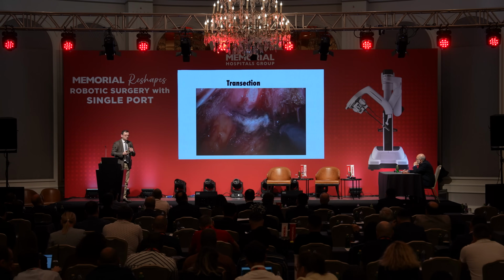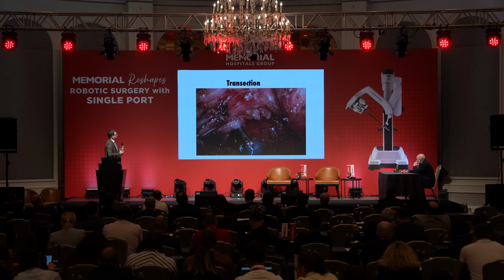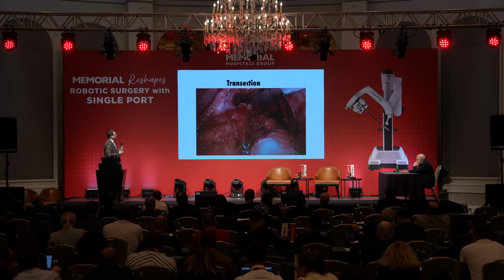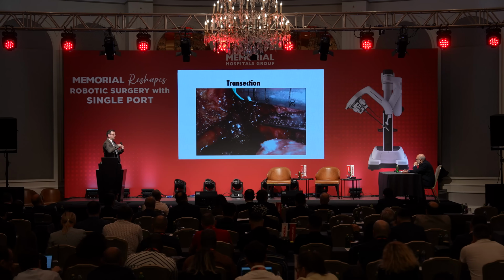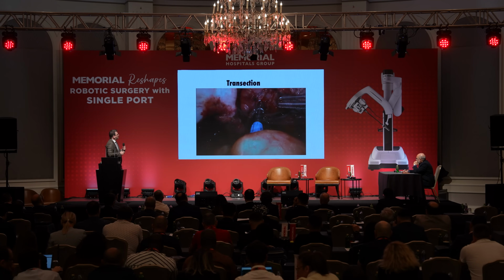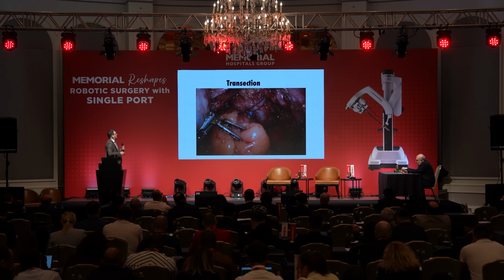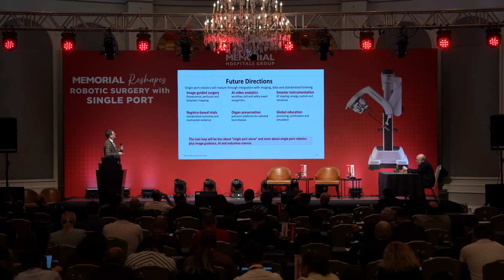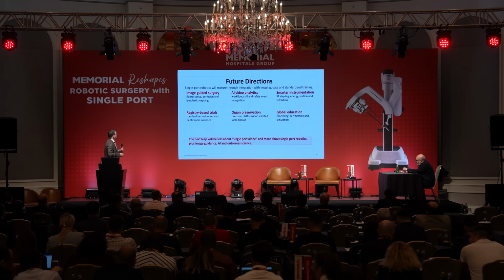Unfortunately, in our country, we don't have the single port stapler yet. So it's a drawback. For stapling, you have to create an additional port. The single port entrance area is not appropriate for rectal transections, but the FDA approved this device. I think we will have it shortly. Then we will maybe create more advanced applications when we have more experience with the single port.